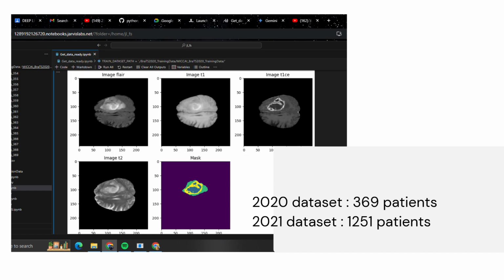We could go with any of the images, but the drawback is, as it is a 3D image which is represented in a 3D array, every x, y, z point will only have one value. By using three highly contrast images, every x, y, and z point will have three values as we are stacking these three images. In the pre-processing part, we will be stacking the three MRI scans, and there is a mask for each patient which represents a tumor with exact position.